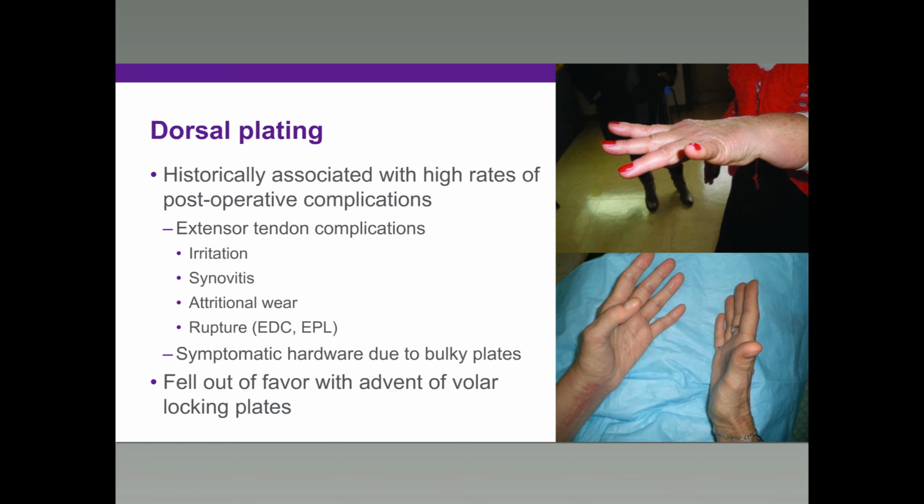Those of you who've been in the business for a million years like me know that generally when you would hear dorsal plating, people would gasp and it was a terrible thing. It was historically associated with really high rates of postoperative complications, specifically extensor tendon complications, irritations, synovitis, attritional wear, and rupture of both EDC and EPL tendons. The plates were also relatively bulky, so you tended to have symptomatic hardware. And once volar plates came around, it really fell out of favor.